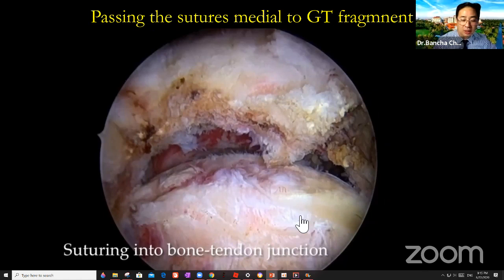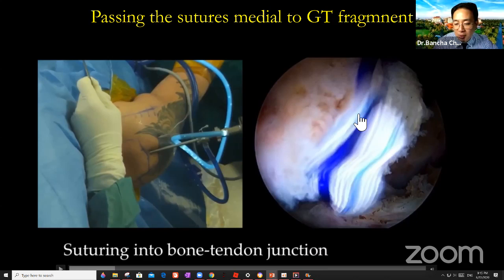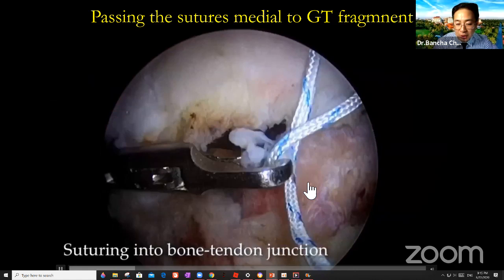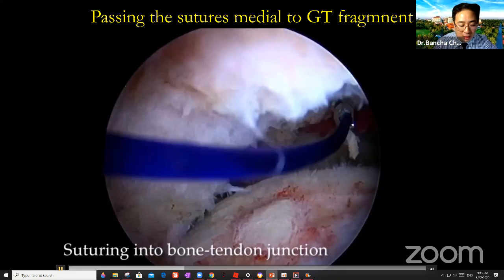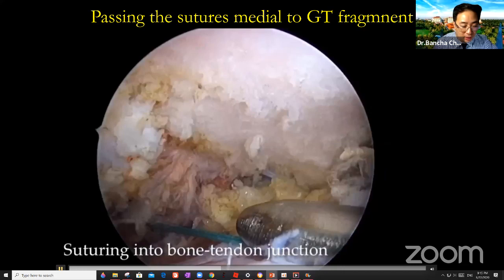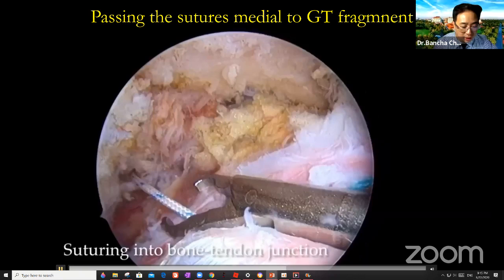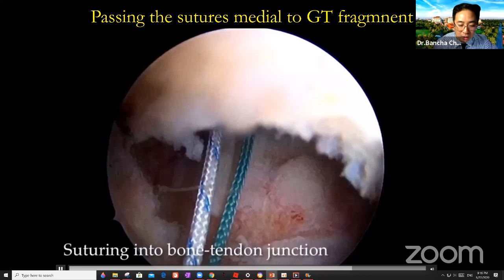I use the suture hook. The way to go is I go medial, just at the bone-tendon junction. Using a suture hook, I pass the suture first, like a shuttle. I use shuttles in different colors, one and then another one. Not into the bone, but into the bone-tendon junction. That way we use different sutures so we're not confused. And then try to reduce.